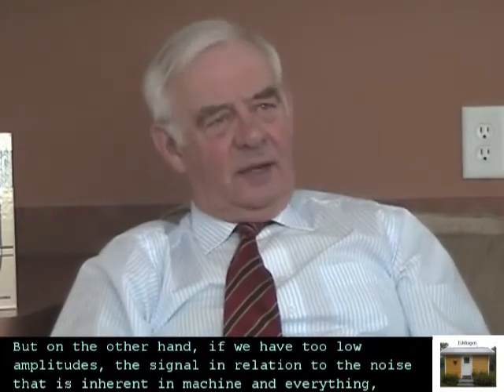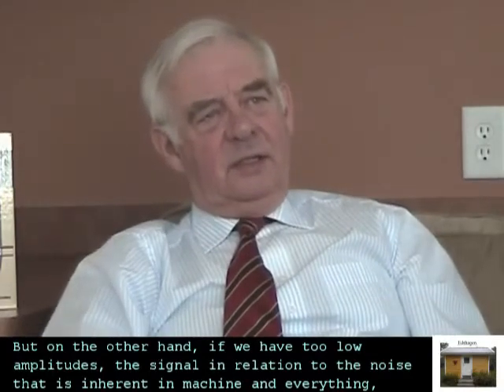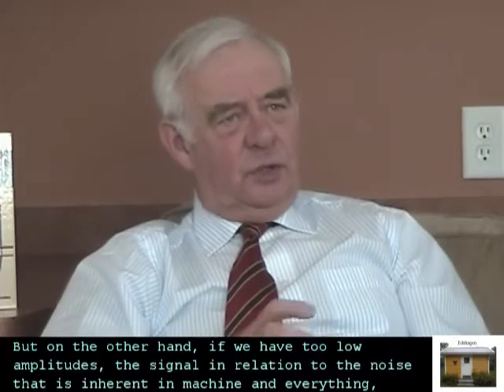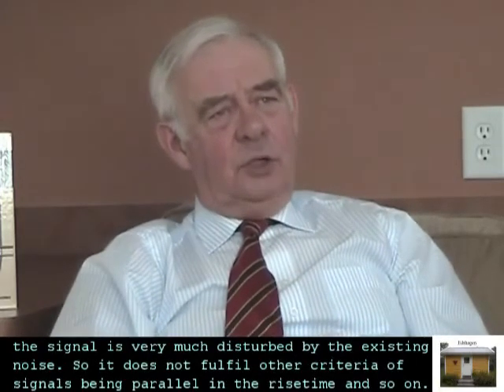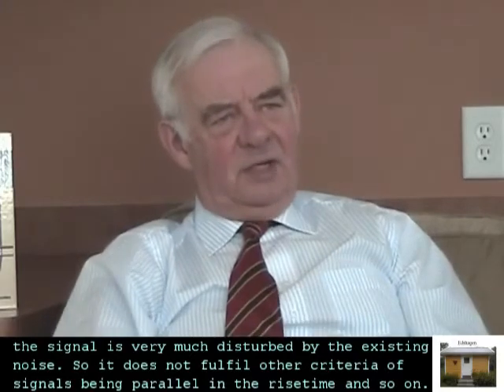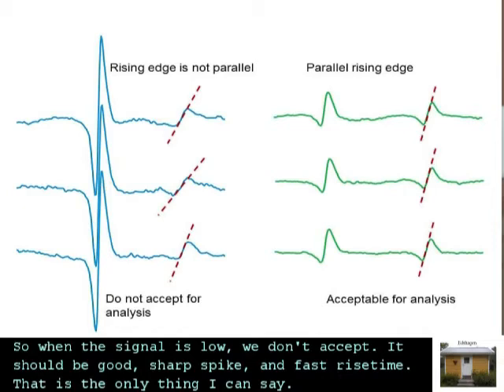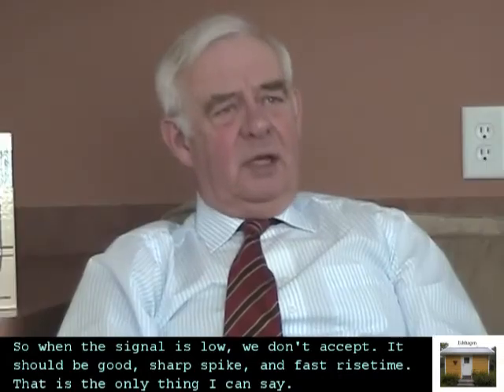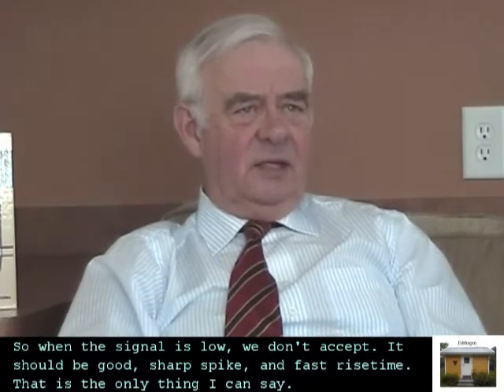But on the other hand, if we have too low amplitudes, the signal in relation to the noise that is inherent in the machine and everything is very much disturbed by the existing noise, so it does not fulfill other criteria of signals being parallel in the rise time and so on. So when the signal is low, we don't accept. It should be a good, sharp spike, with fast rise time. That is the only thing I can say.